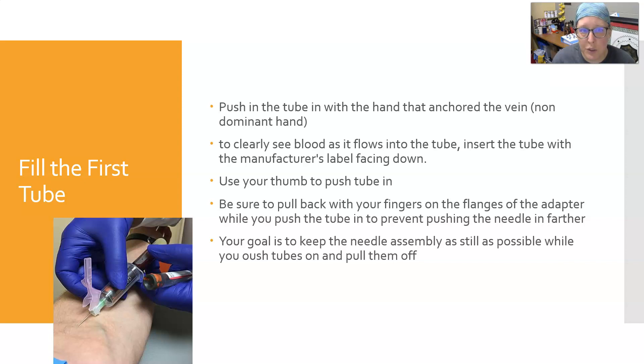Fill the first tube by pushing the tube in with the non-dominant hand — you've let go of the vein because you're in the vein now, so use that hand to push tubes on and remove them. Insert the tube with the manufacturer's label facing down so you can clearly see how much blood is in there. Most people use their thumb to push the tube in. While pushing the tube in, pull back with your fingers on the flanges of the adapter to prevent pushing the needle in further — an opposing force.